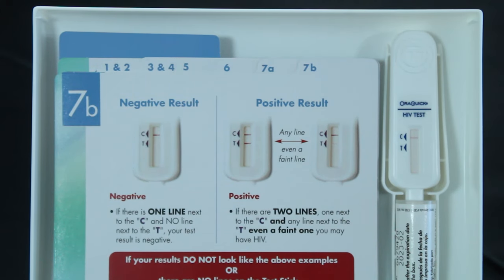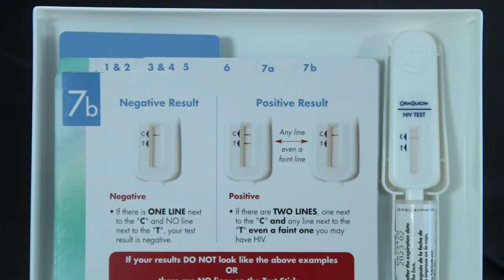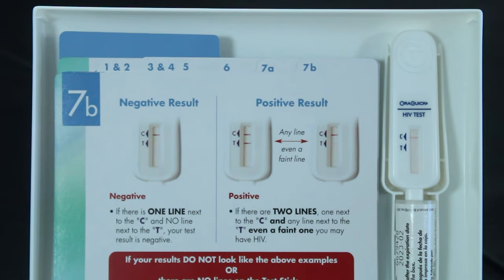You're going to see two spaces for lines — you're going to see a C and a T. The C is the control section; you should see a line there, which means that the sample actually took. If you see two lines, even if the second line is faded, that is an indication that this is probably a positive test and you need to go see a physician for a confirming test.